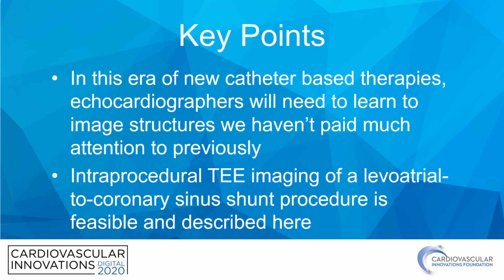Key points. In this era of new catheter-based therapies, echocardiographers will need to learn to image structures we haven't paid much attention to previously. Intraprocedural TEE imaging of a levoatrial to coronary sinus shunt procedure is feasible and is described here.